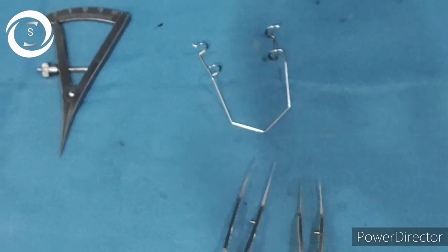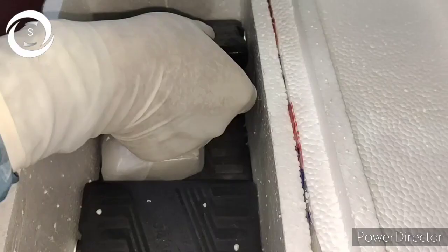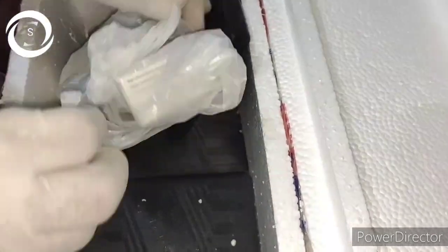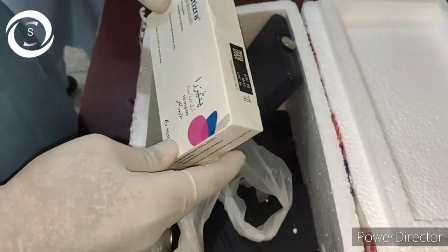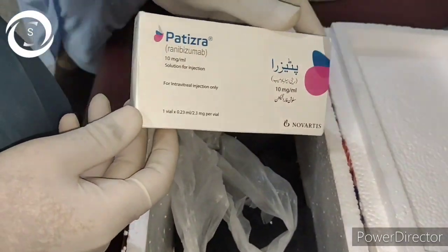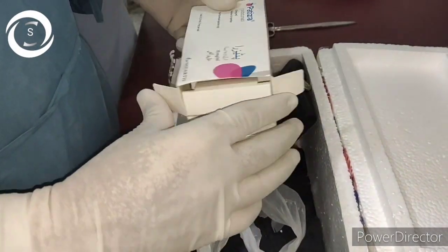But in my technique I prefer more diluted povidone iodine. Like I take 1 ml of 10% ready-made solution and put 4 ml distilled water to make it 2%. Literature also says that more diluted povidone iodine is more potent and less toxic to the cornea and conjunctiva.